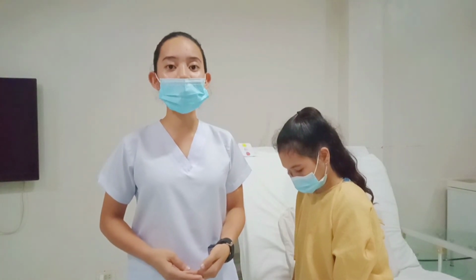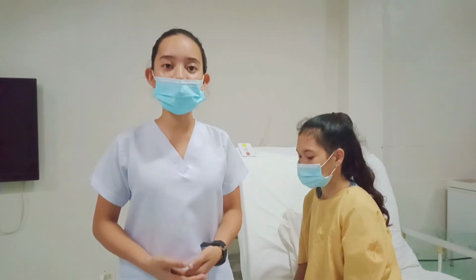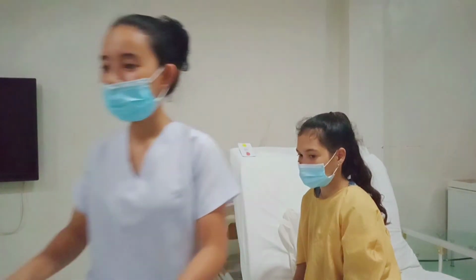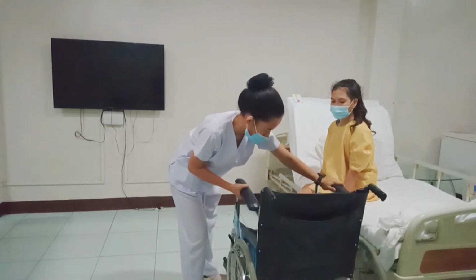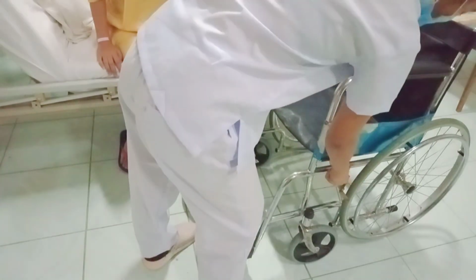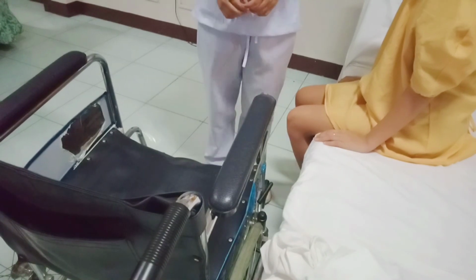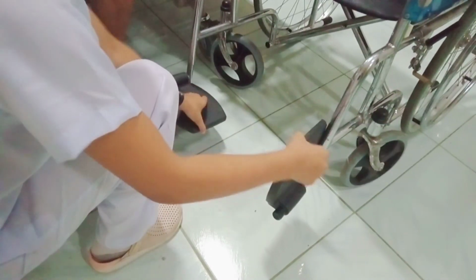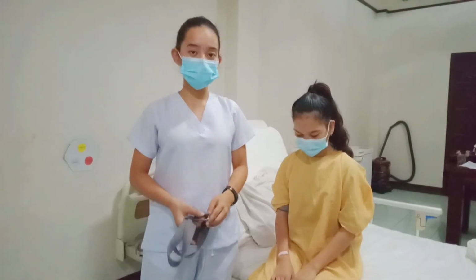Allow client to sit for a few minutes to prevent lightheadedness or orthostatic hypotension. And then angle wheelchair to bed on client's stronger side. And then lock or brace bed and wheelchair. And then let's use some gait belt.